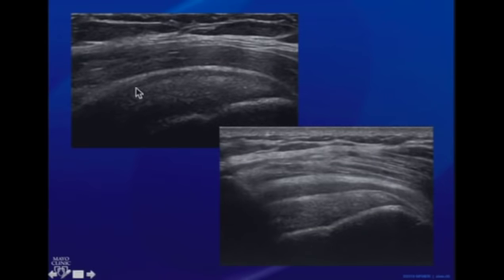In this case, you can see that the bursa is slightly thickened and the underlying tendon itself is heterogeneous. It can sometimes be confusing to know where is the bursa and where is the tendon, and it makes sense that you do some abduction movements to find out if the whole thing is a tendon or a bursa. If you do abduction, then the bursa stays in its place, whereas the tendon is going to show movement.